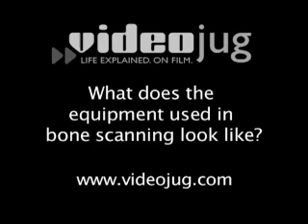What does the equipment used in bone scanning look like? The equipment that is used for bone scanning is basically the same as the equipment that we use in other general nuclear medicine areas and in nuclear cardiology. They are either planar or SPECT systems which have gamma camera heads which collect the gamma rays from inside the patient and form an image through a computer.